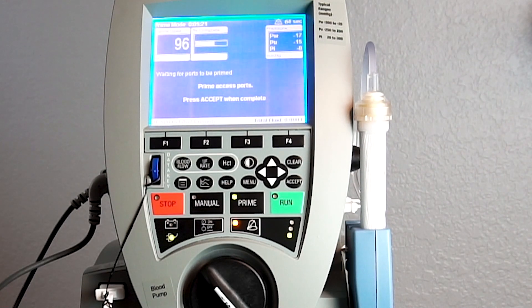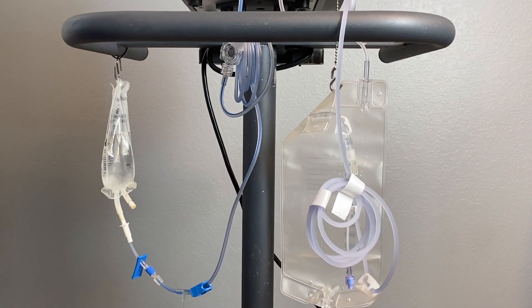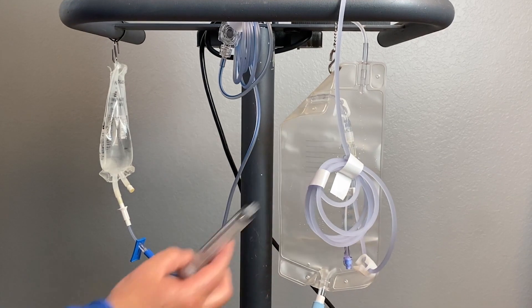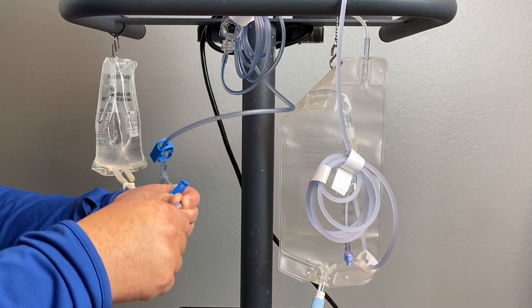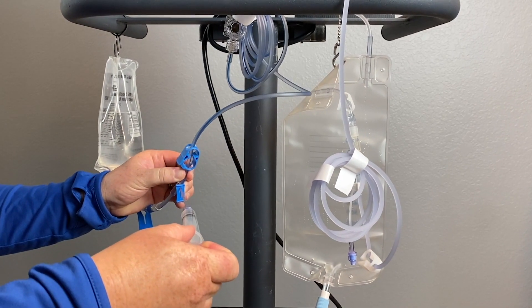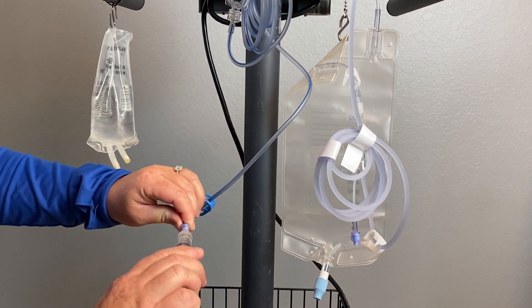We'll walk through the steps in order to do this. You'll need an empty 10 milliliter syringe. Connect the syringe to the blue access port on the withdrawal side and withdraw about 5 milliliters of saline. Clamp the access port and disconnect.